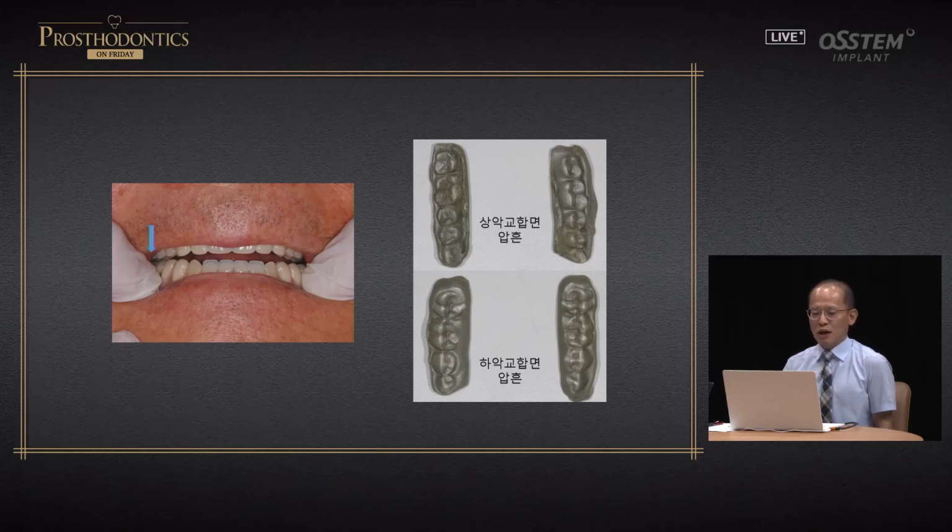Remounting is the key. So check bite, doing it again with 2 millimeters of check bite is my recommendation. Here, it's not 4 bites, you make 2, one maxillary and one mandibular. Just make it not too transparent. If it's too thick, of course it could result in errors. So again, 2 millimeters should be the optimal thickness.